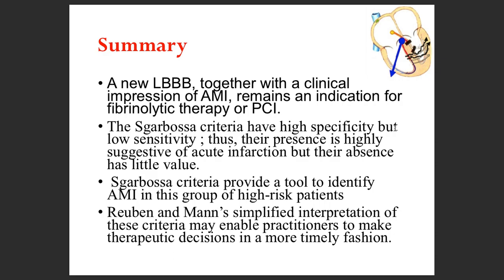However, even now, Sgarbossa criteria is widely applicable. It is a standard criteria and it is acceptable, in fact. Being in the UK, one of the key things is that if you are practicing medicine in the UK, and I'm sure someone will have plans to practice in Australia, maybe Canada, or the US or anywhere else, in the UK we follow NICE guidelines. That's what is more important, and anywhere else in the world, Sgarbossa criteria is going to be valid enough. That is one of the key messages. I hope you all understood it. If there's a new onset left bundle branch block, alert.